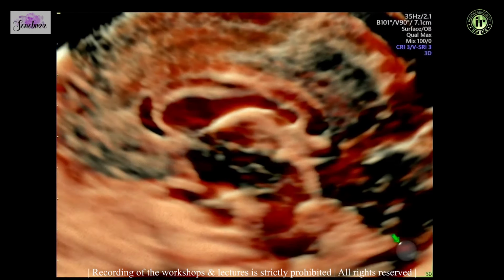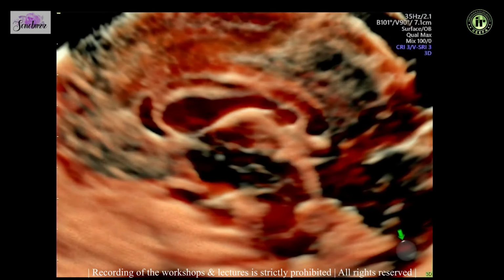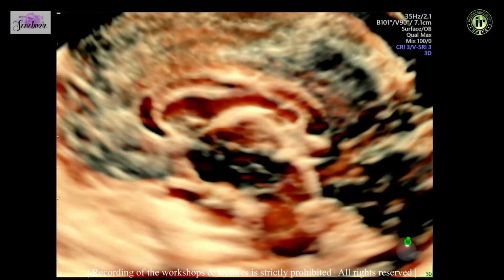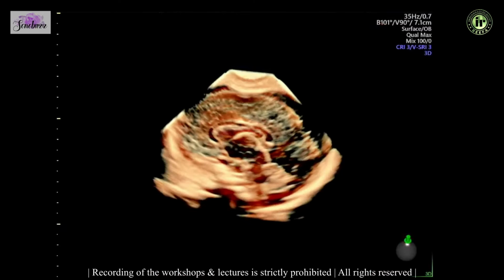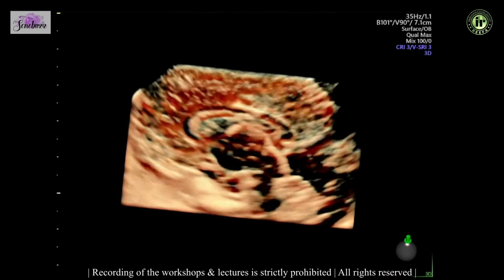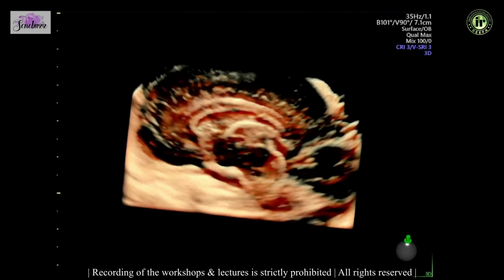You can play with the light and highlight the margins of the corpus callosum. And that's the perfect midline.